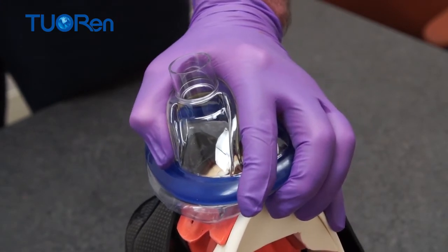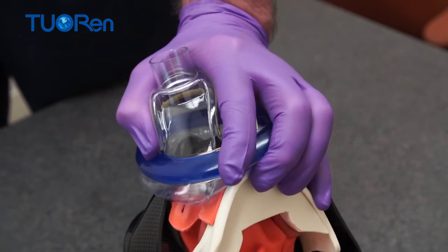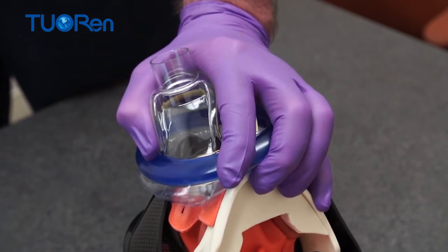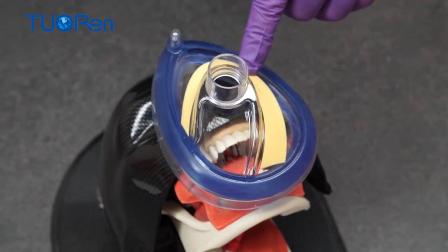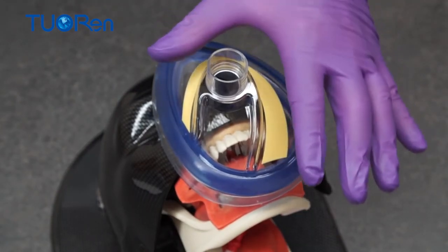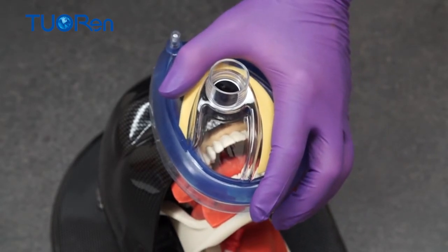Pressing the mask on the face and squeezing the mask from side to side implements the seal. Pulling the chin up without pressing on the submandibular soft tissue implements the airway maneuver. The color marking reinforces the correct grip. A grip covering only partially the color marking signals a sub-optimal attempt.